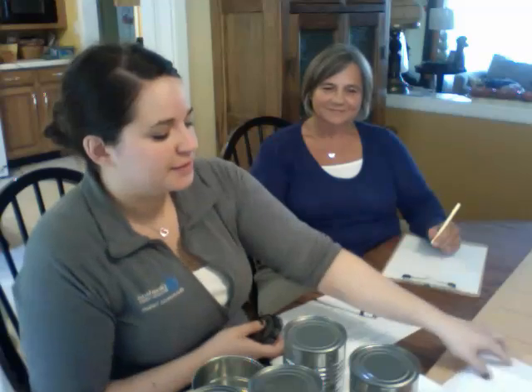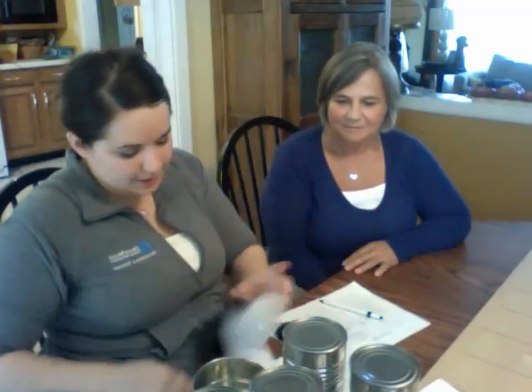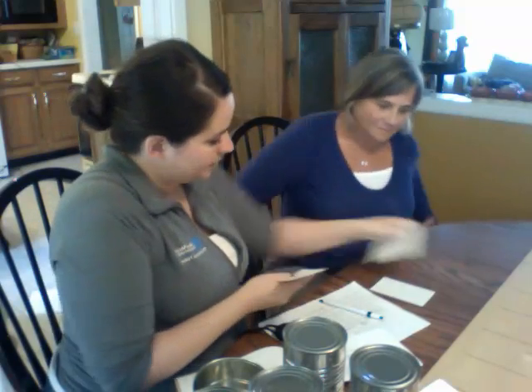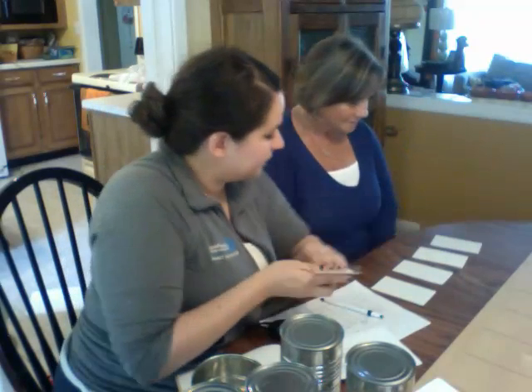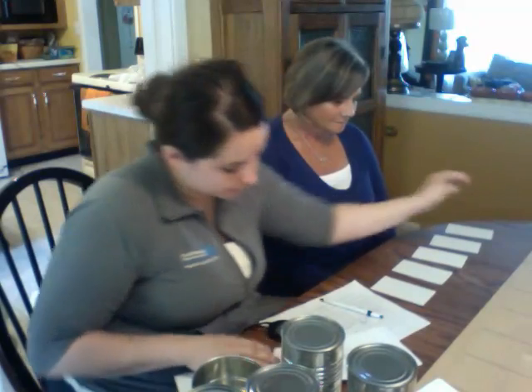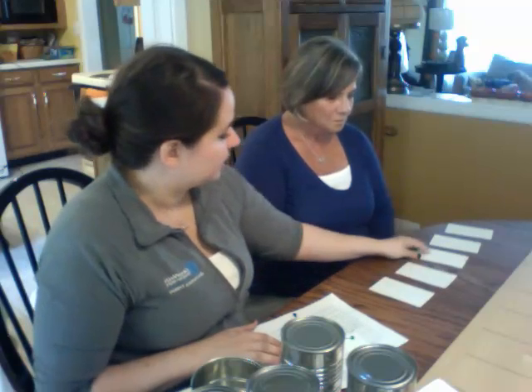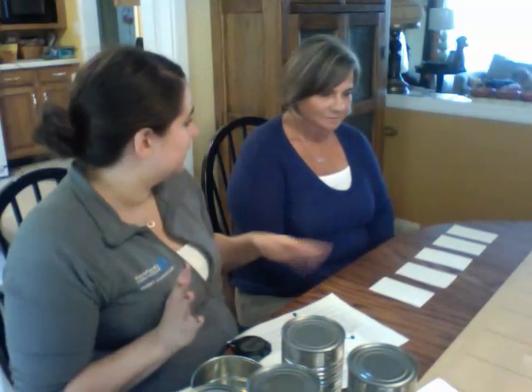All right. So this, as I explained to you, this test has several subtests. So I'm going to go ahead and set up the next one. And the next one, we're going to be turning over these cards. Let me place them directly in front of you. You're going to place your left hand on the table. And when I say go, you're going to use your left hand to turn over the cards as quickly as you can, one at a time, okay? You can turn them over in any way that you wish, and they don't need to be in any pattern when you're finished. Do you understand?